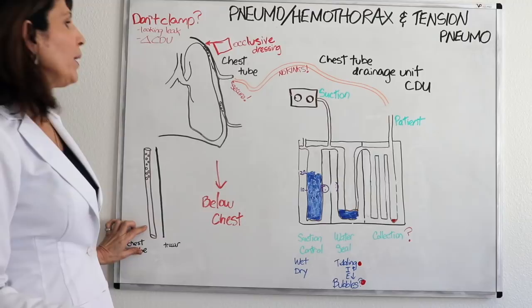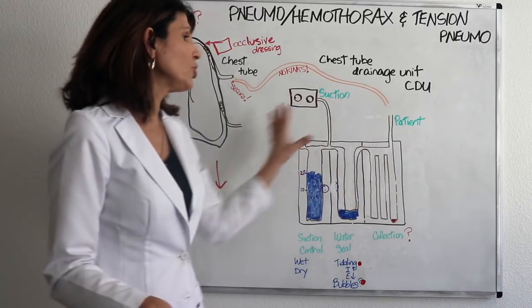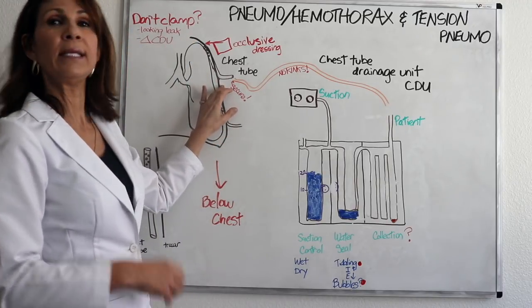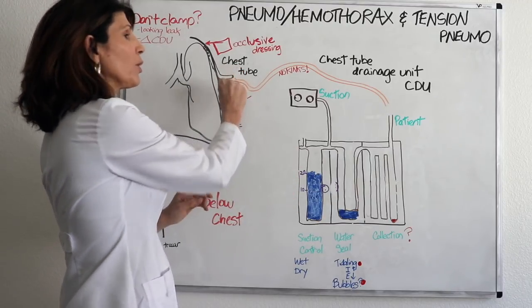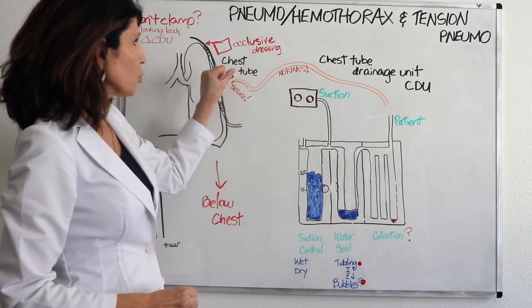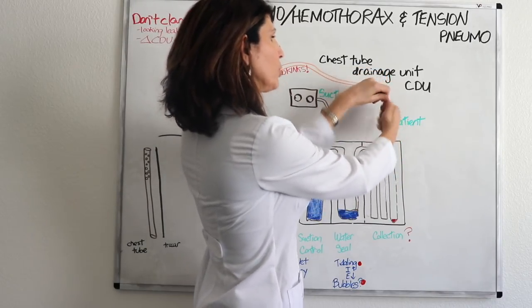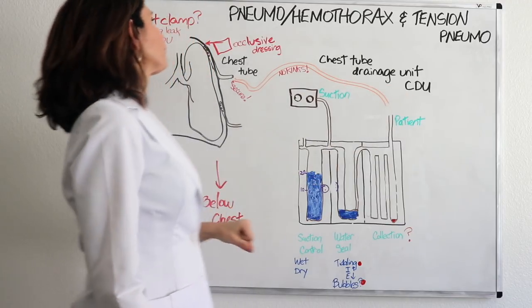From the point of the chest tube to the tubing that actually attaches to the chest tube drainage unit, you need to have very secure connections. So upon placing the actual chest tube in the pleural space to the point where you're done, you have to make sure that it's taped and secure at every point. There's a minimum of one point, and that's usually a male-female adapter that you can screw in to ensure a good secure attachment.